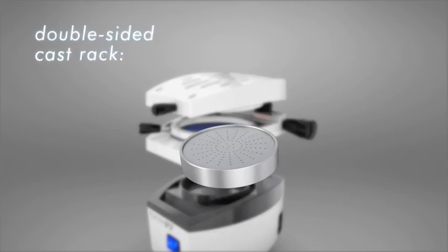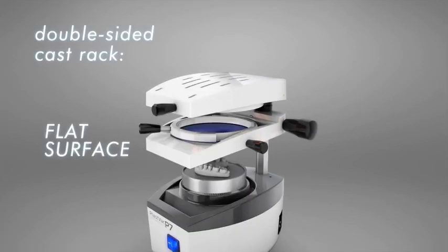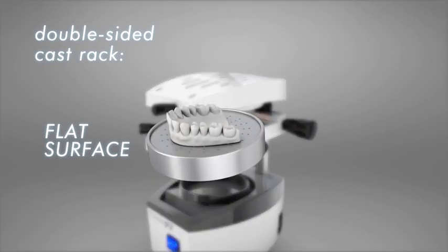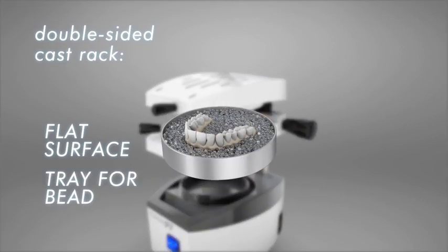It has a double-sided cast rack. The flat surface is indicated for soft sheets and casts with a good finishing. The tray for beads is indicated for hard sheets and non-finishing casts.